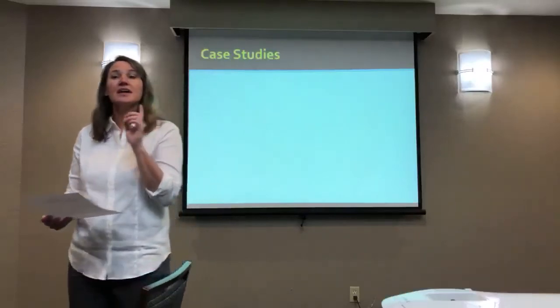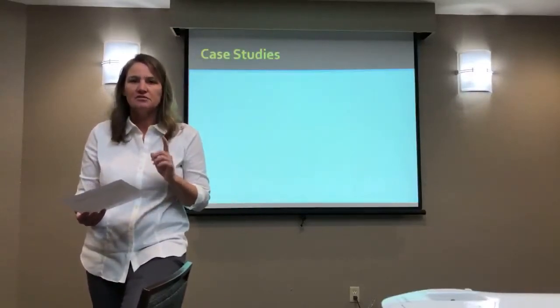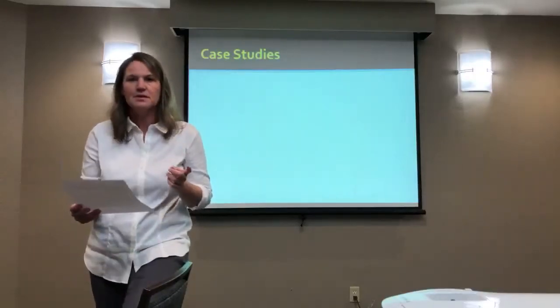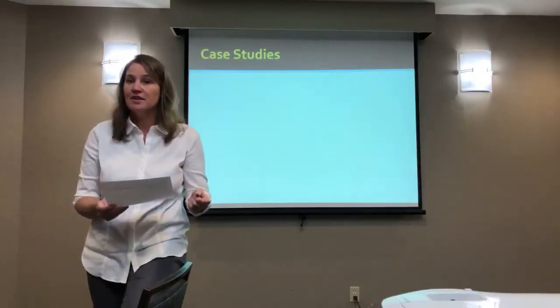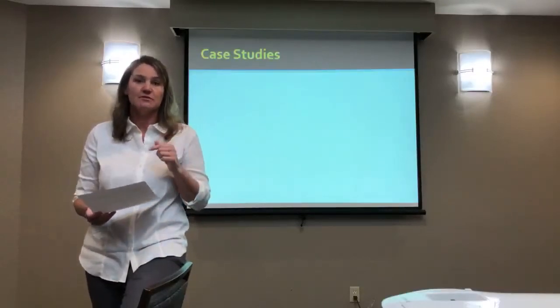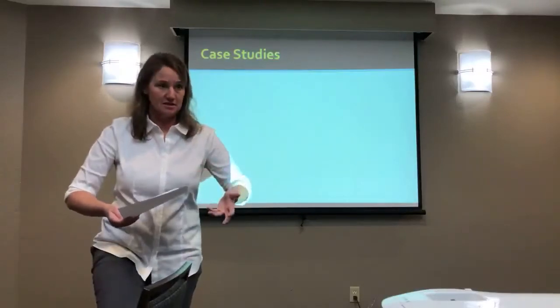So this is one of those that says that. Even with that in mind, I still put it on my case study simply because when I do use ultrasound, it's almost always on a shoulder. And the reason I use it is almost always because they have a limited range of motion. And is the outcome better than if I didn't use it? Well, I don't know. I can't tell you for sure, but I think it is, and I think it's a less painful process too. I also use E-stim on a lot of them because many times there's a motor impairment adding to this.